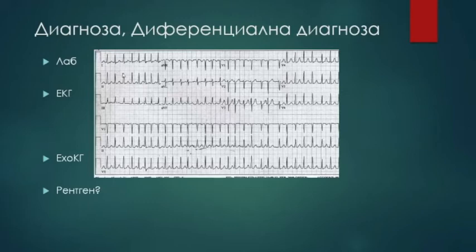So, yes, it's around 1.2 big squares, or let's check: 1,500 divided by 7, let's say. Can somebody... A little over 200? 1,500 divided by 7. 200-ish. Something like that. So the heart rate is around 200, right?